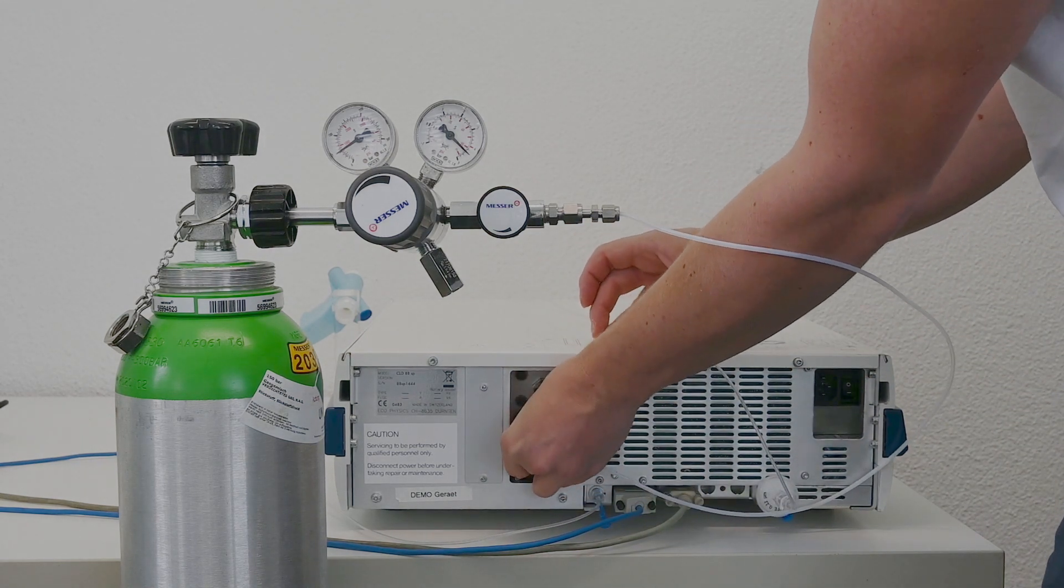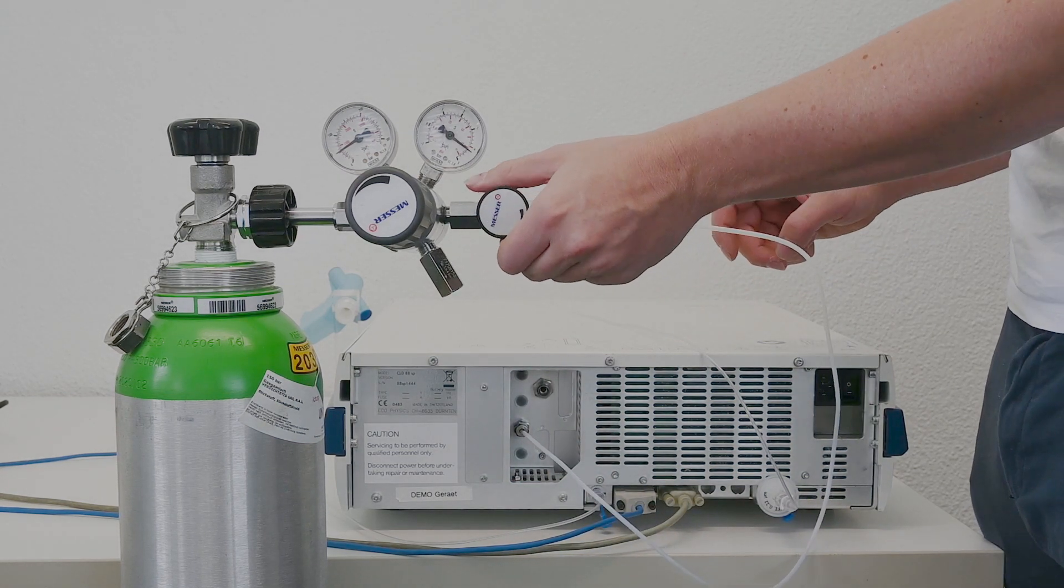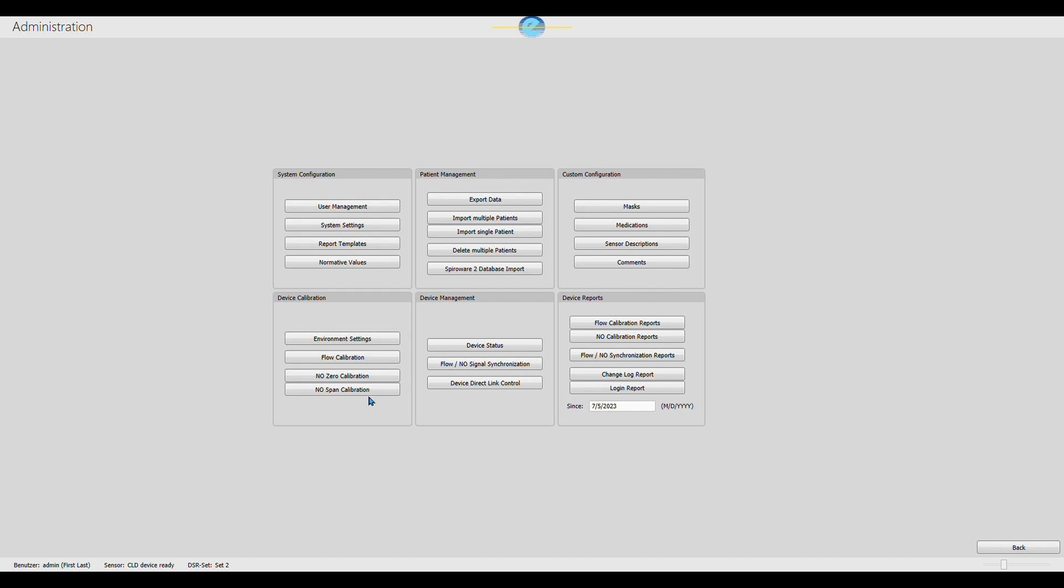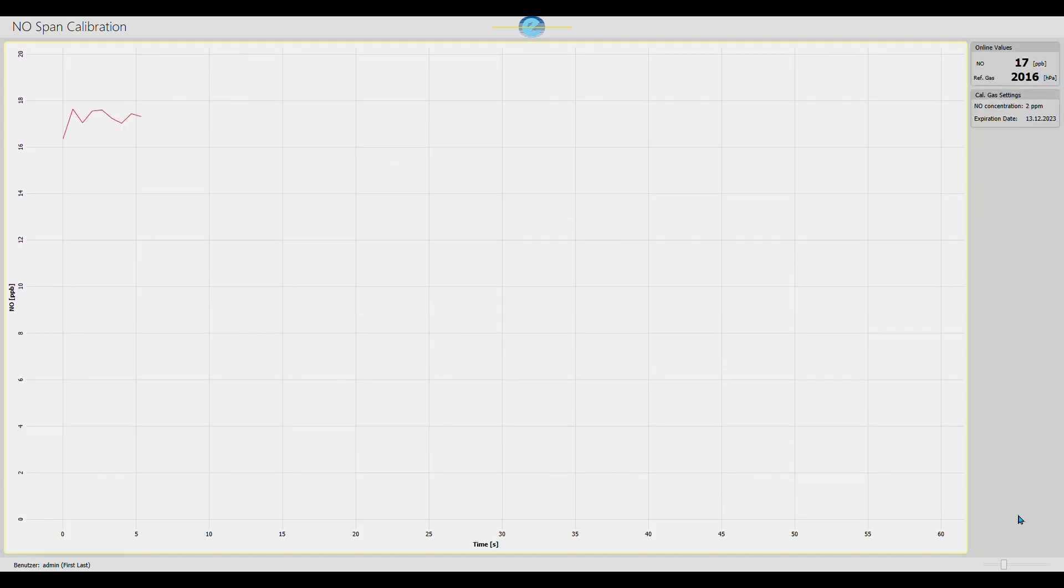Connect the gas cylinder to the CLD88 and set the inlet pressure to 3 to 8 bar. Enter the NO concentration and expiration date as specified on the gas bottle. Then, click on Confirm to start the NO span calibration.